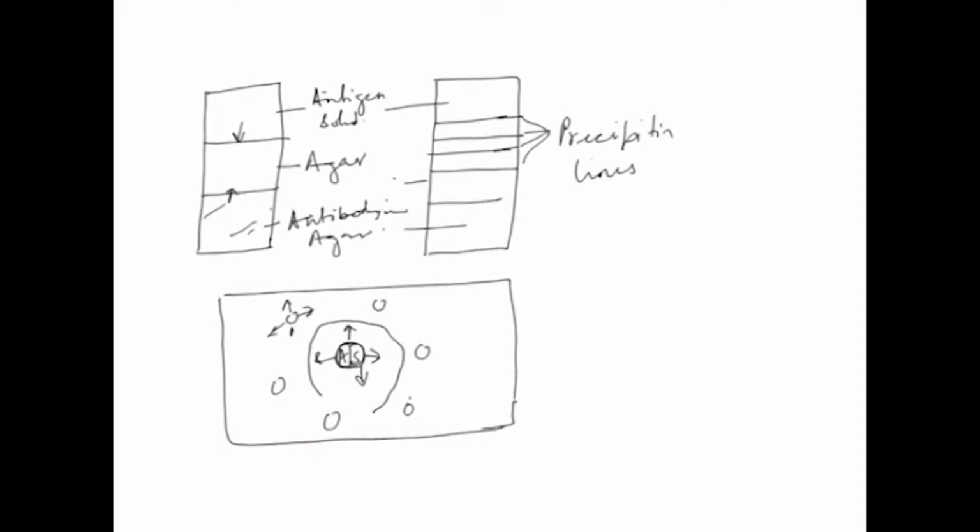Now, there is another important part of double immunodiffusion, which is how the lines look: reaction of identity, partial identity, or non-identity are very important. For example, what happens if you have the same antigenic determinants, if there is partial resemblance in antigenic determinants, or if there is no resemblance in antigenic determinants. So, let us see what that is.